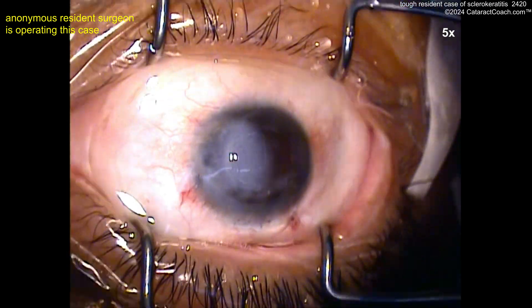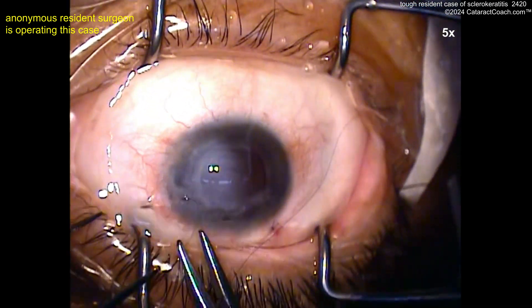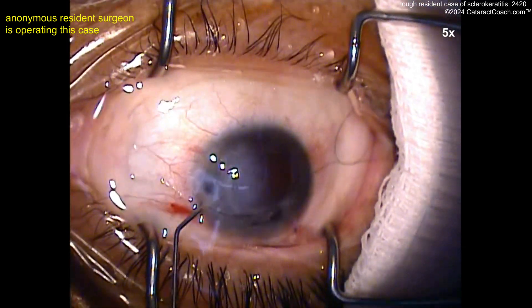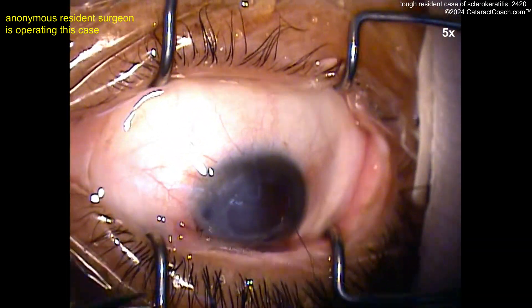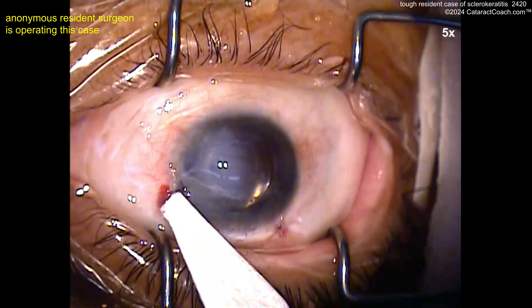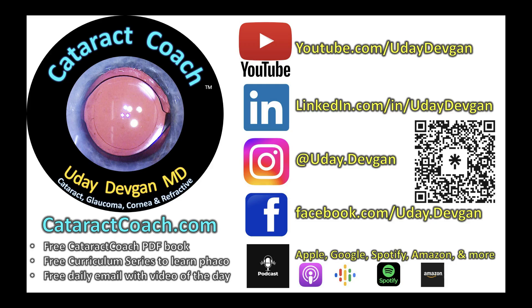Easy here people — you're hydrating half the cornea! I was just about to give you a compliment and you're hydrating literally 50% of the cornea. The patient is going to have terrible vision the next day. You've got to watch some Cataract Coach videos — we don't do that with the hydration. Good job, I appreciate the effort. Check out cataractcoach.com. Thank you.